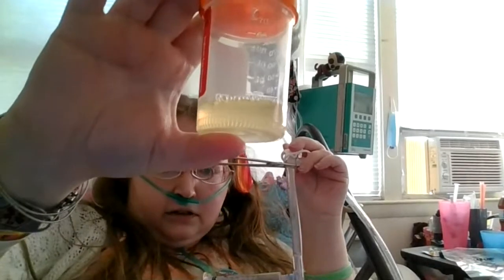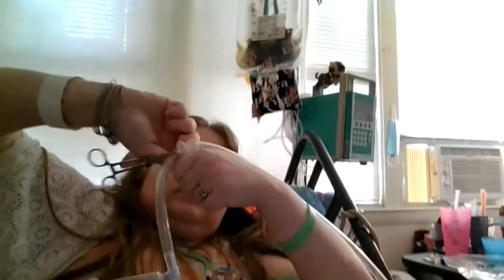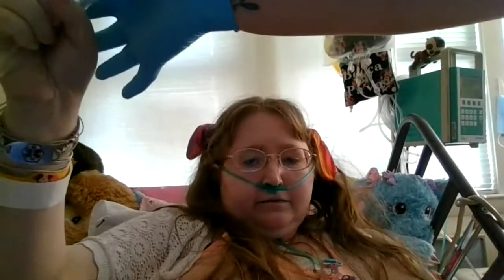I'm going to put this down and then undo the clamps. This is the first clamp I undo, and then when I undo the second clamp I'm going to get a rush of urine come out. There it goes - a whole bunch of bladder spasms. It's not going to feel good. The clamps were blocking off my urine flow.